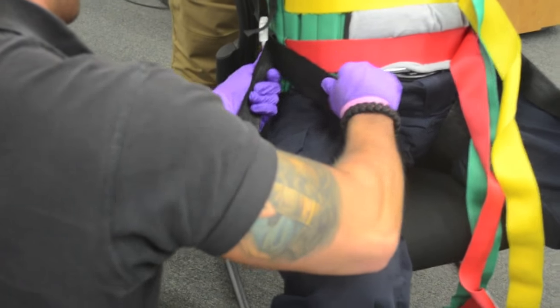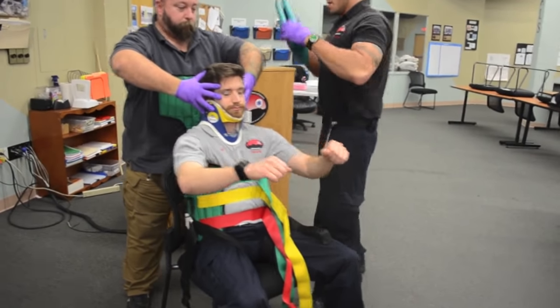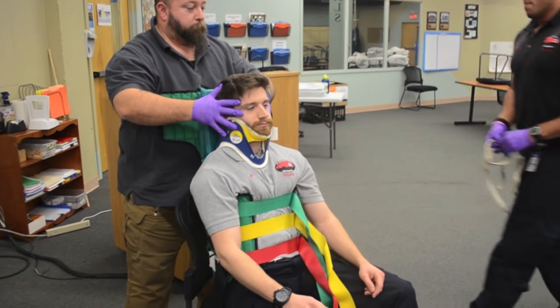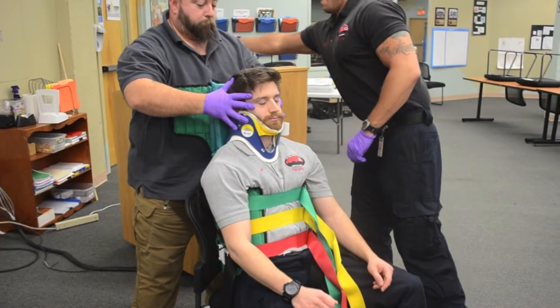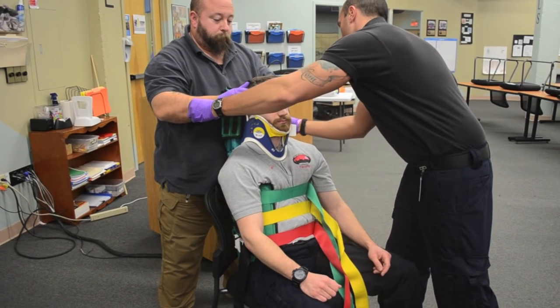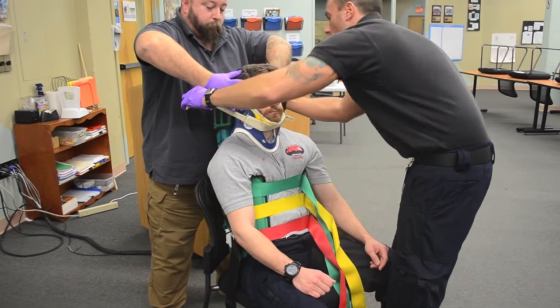Bring in the other leg strap. At this time I'm going to pad for any voids I see behind the back. Secure the head. Secure the top forehead strap, angling it down. Lower chin strap, angling it up, making an X on both sides.